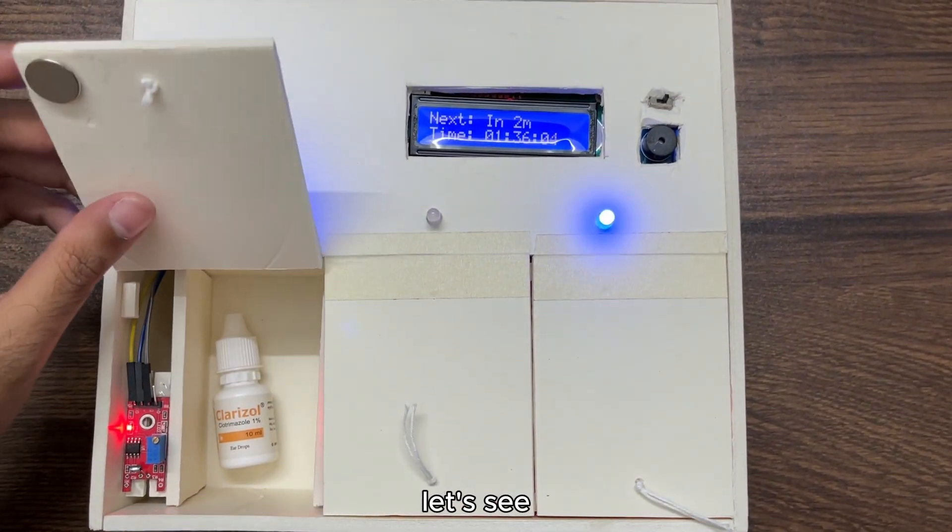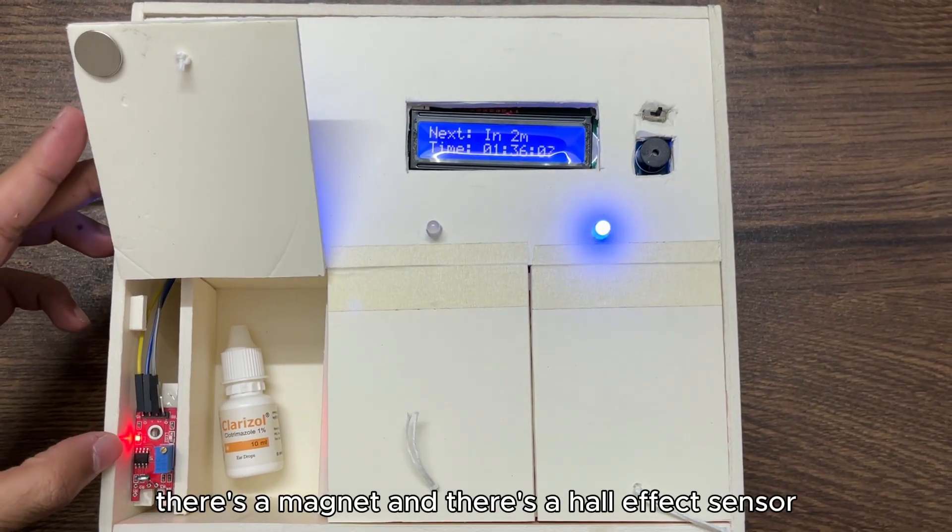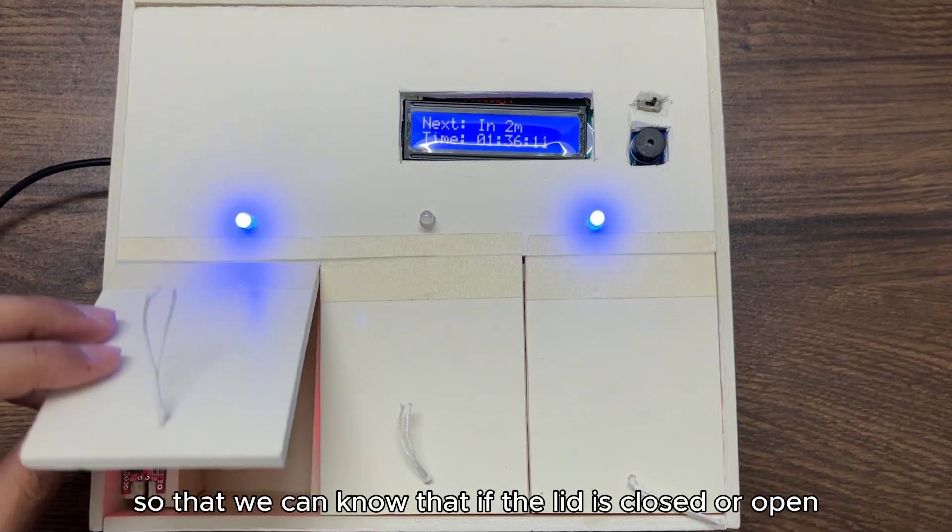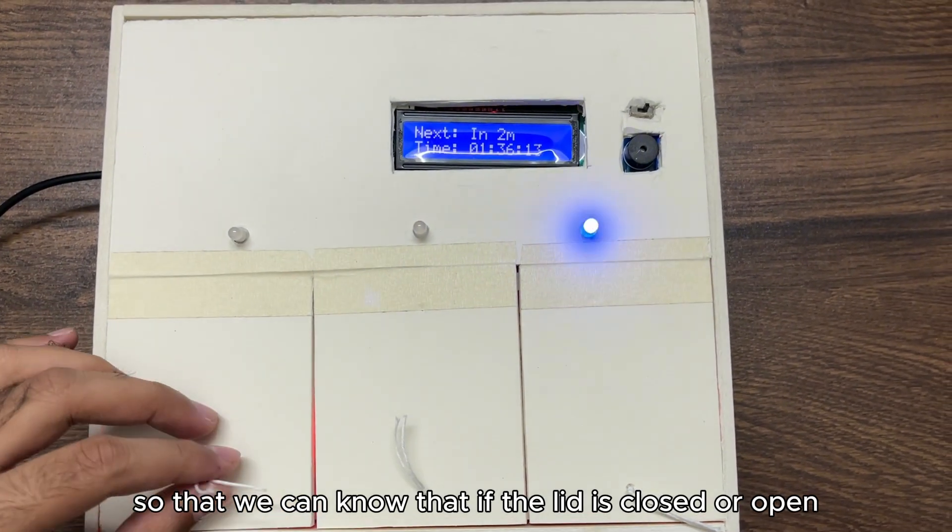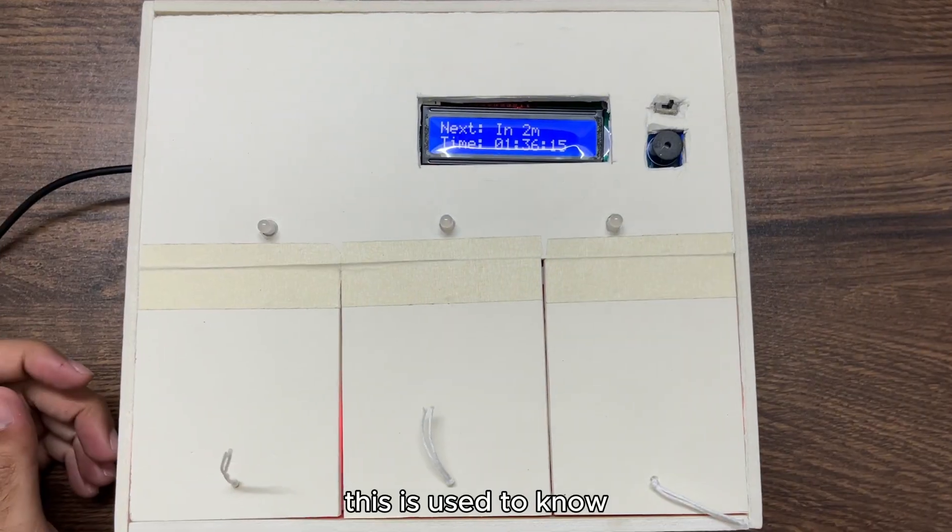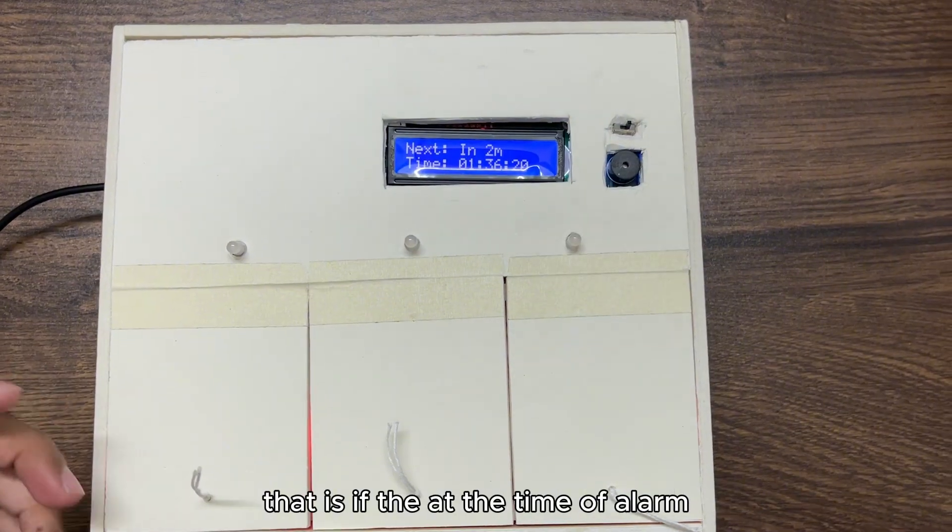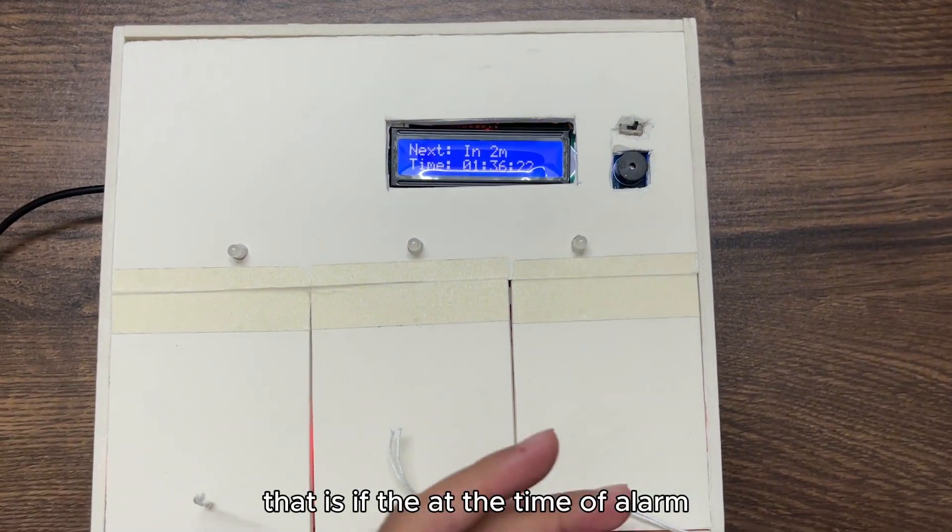In the meantime, there's a magnet and there's a hall effect sensor. These things are used so that we can know if the lid is closed or open to register. This is also used to know, to register, if the user has taken medicine or not.